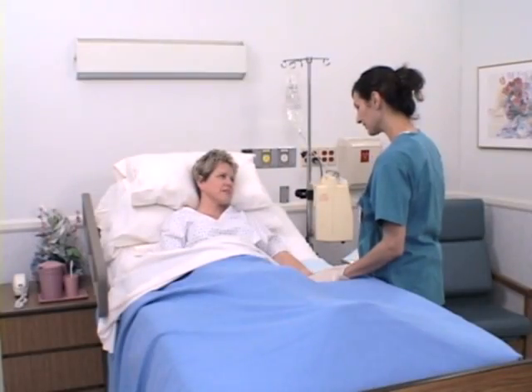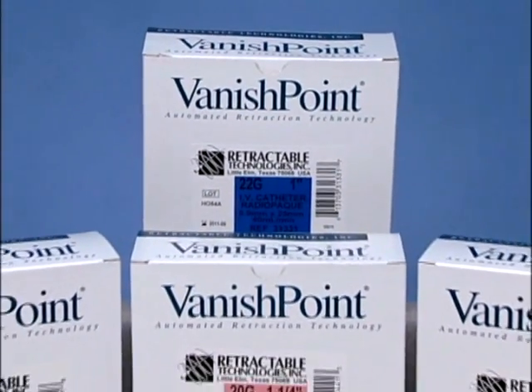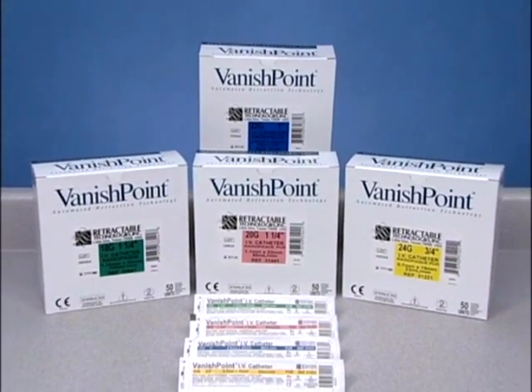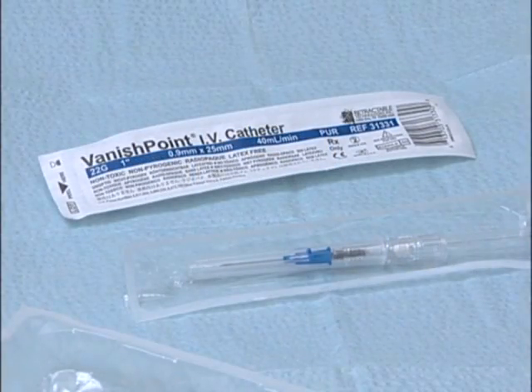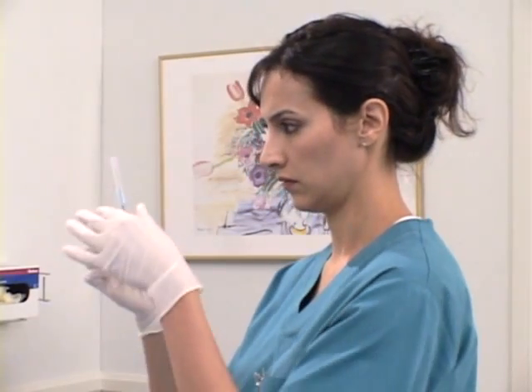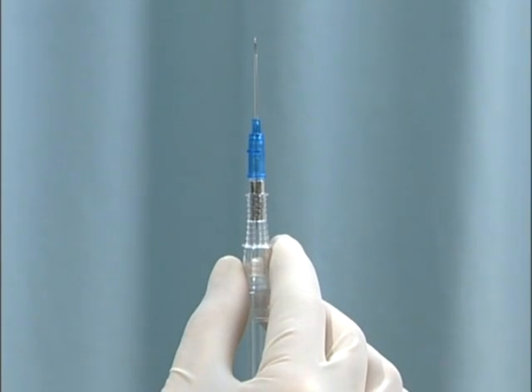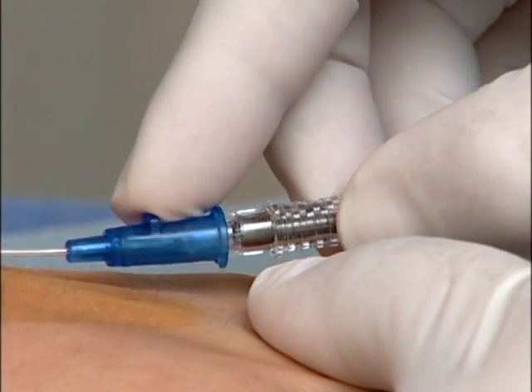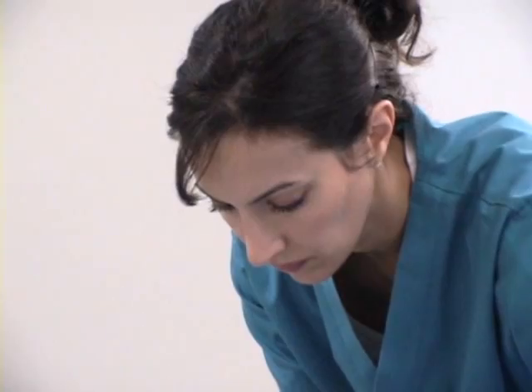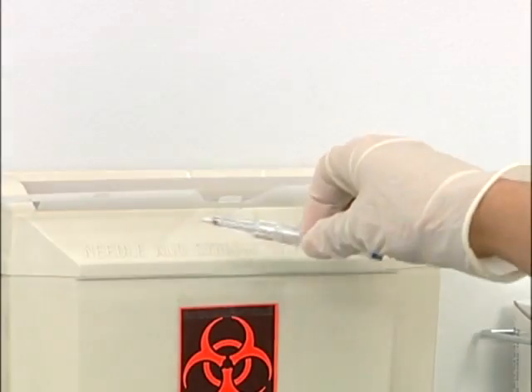So far, we have watched venipuncture with the Vanishpoint IV catheter performed very slowly or in stages for clarity and learning purposes. Of course, in daily use, the Vanishpoint IV catheter is so easy to use that the entire procedure is as quick as any venipuncture. The Vanishpoint IV catheter minimizes exposure to the contaminated needle. If used properly, the needle is automatically retracted into a housing, effectively reducing the risk of needle stick injuries, and can then be properly disposed of.